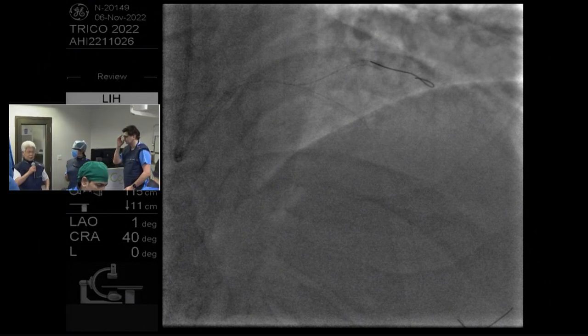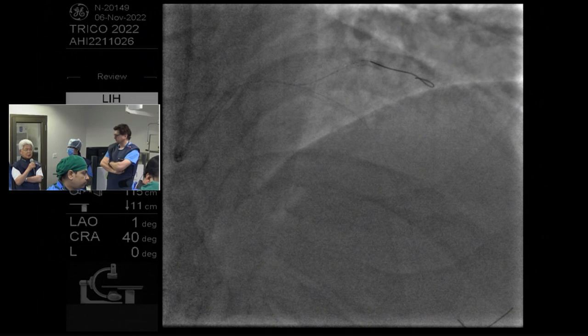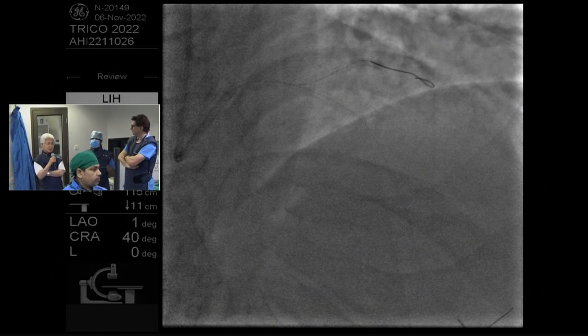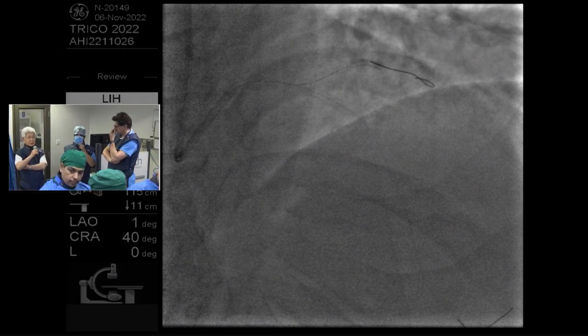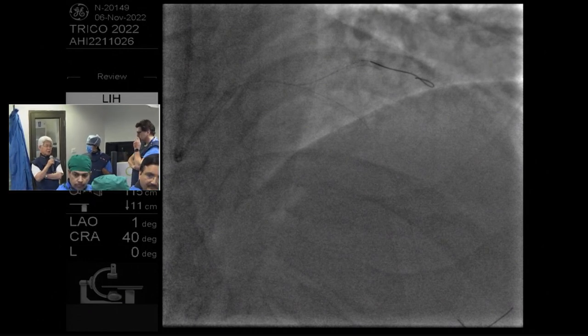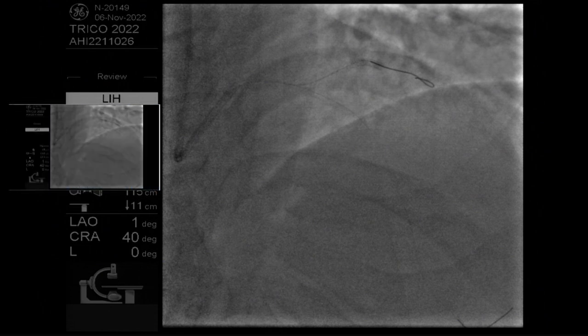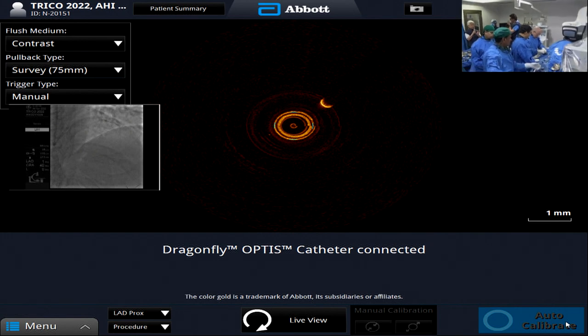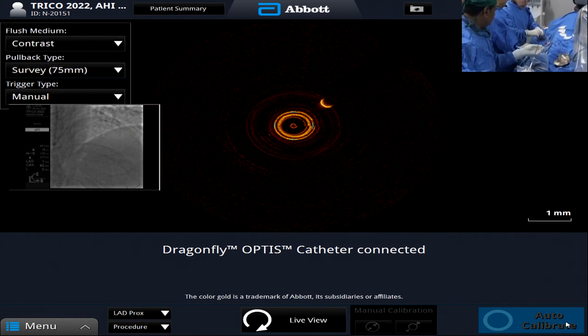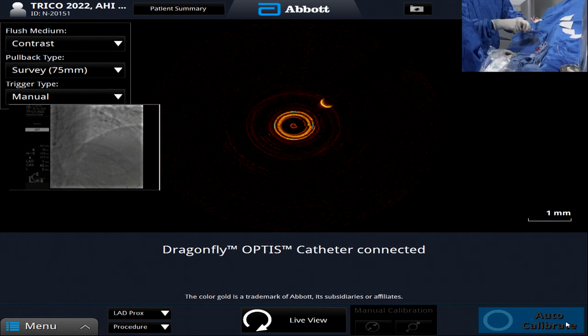Yes, it's a very important question. If it is difficult to cross the lesion, if the OCT catheter could not cross, I try to do the rotablator or some ablation to get a route to a clear image. So with a balloon, if we can dilate to 2.0 or 2.5 enough, we can get a good image. Anyway, we make the effort to get an image because it is very important to decide the plan to treat the lesion, and decide the size of the balloon or stent and the length. It is very important to identify the morphology and the lesion distribution.